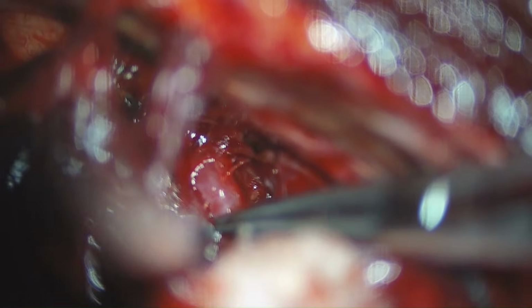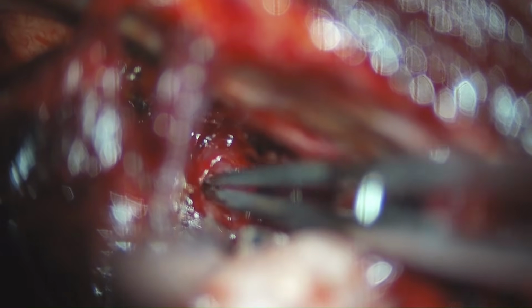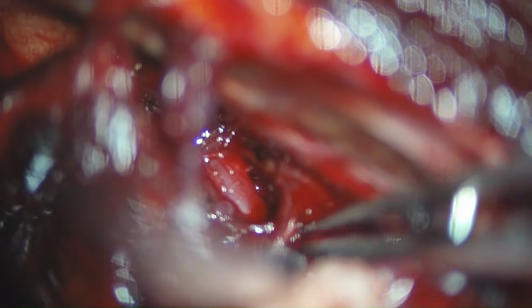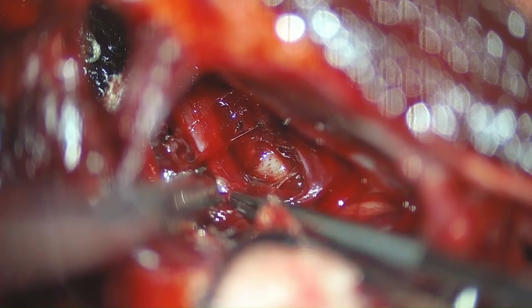So the dura is opened in a routine curvilinear fashion with the dural flaps raised over to the superior sagittal sinus, exposing the interhemispheric area. In the interhemispheric area, there were many vessels that are going directly into the superior sagittal sinus, so the exposure was a bit difficult.